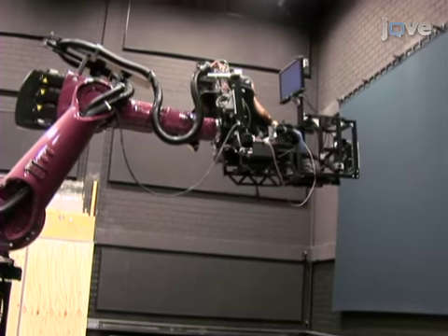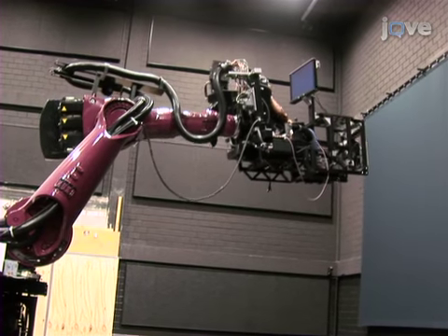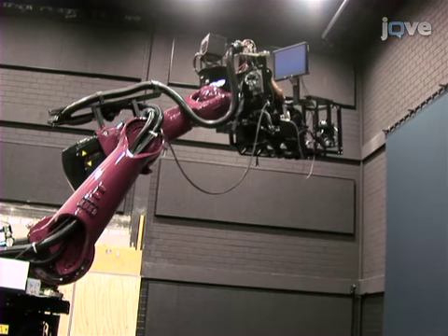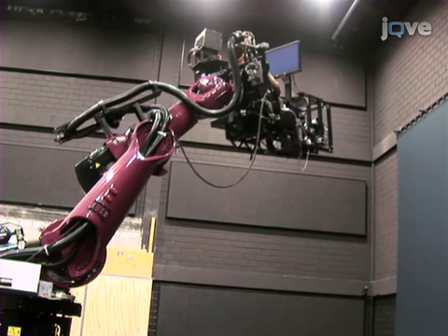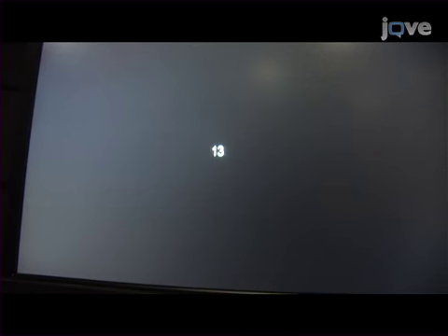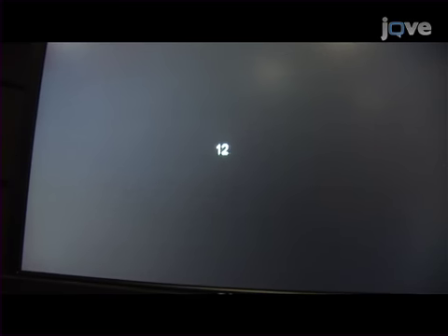Trajectories are delivered as translations without rotation. Every trajectory is followed by a repositioning sequence, followed by a 15-second pause, to reduce any possible interference from motion prior to each trial, and to ensure that the vestibular system is tested from a steady state.